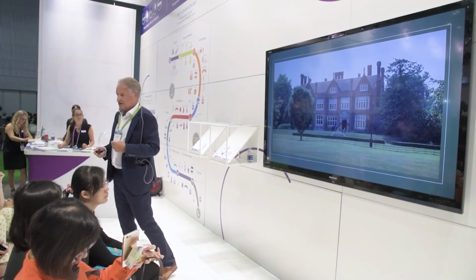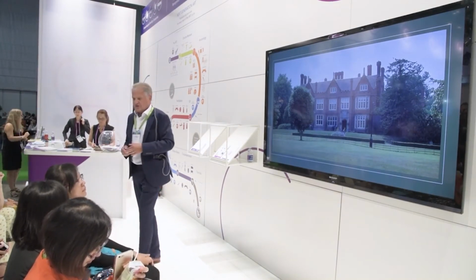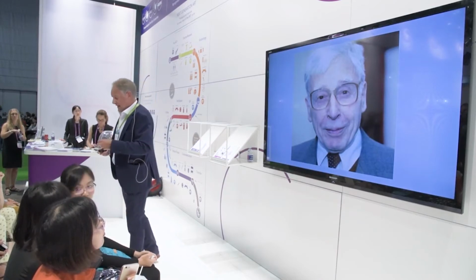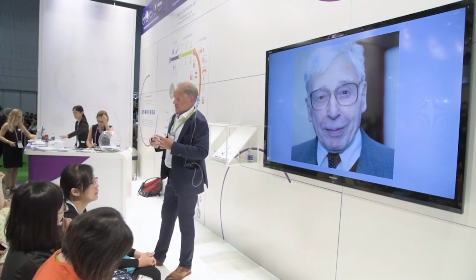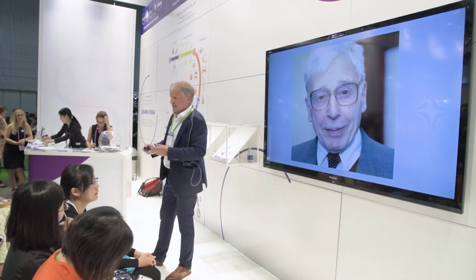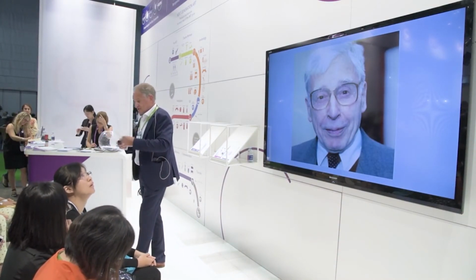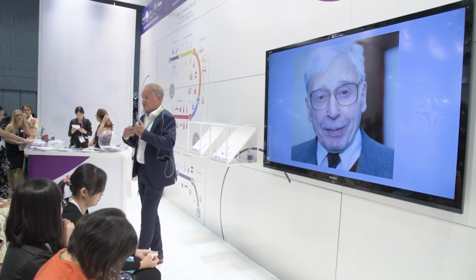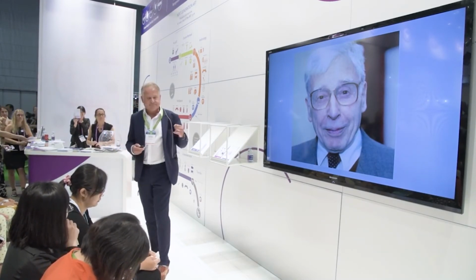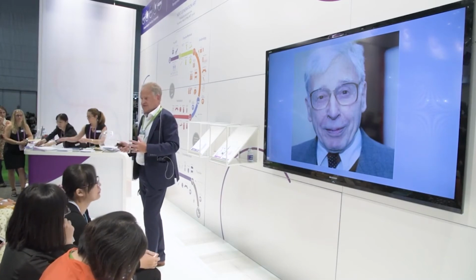I had the privilege in the very early days of working at Bourne Hall Clinic, which is the oldest IVF unit, and my mentor and PhD advisor was Robert Edwards, and he had a friend called Harry Wallace, and it was Robert Edwards who asked Harry Wallace to design for him a catheter that was atraumatic, that could easily penetrate the cervical canal, that could be loaded with embryos safely and carefully, and those embryos could be delivered into the uterine cavity. And really I see the Wallace catheter, which has changed very little over the years, as being the gold standard.